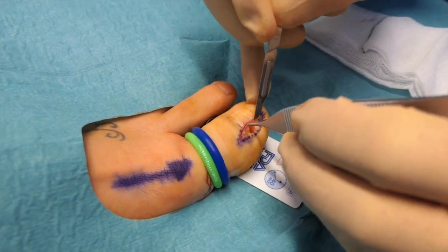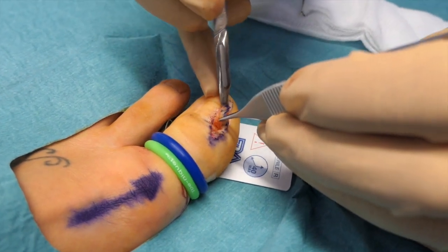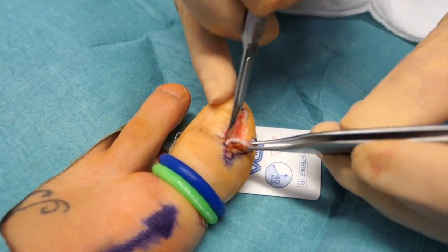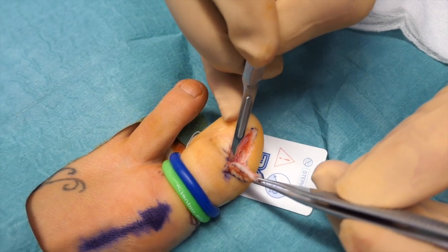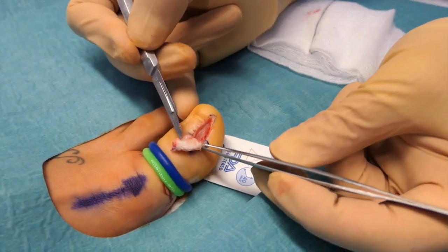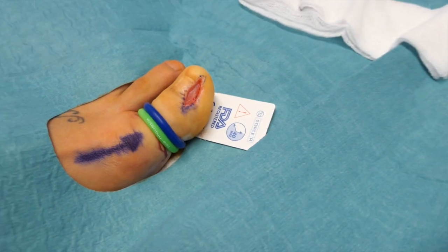Winograd, one of my favourite techniques for incisional, partial. There are many. And then as I raise up that flap, we're coming down to bone. That's all on bone, all on bone, all on bone. And that's the underside. So you can just see how much scar tissue you get, and there'll be some nail matrix within that.